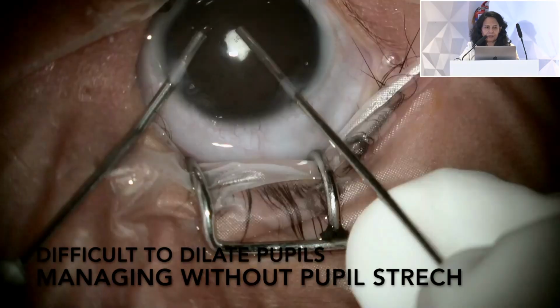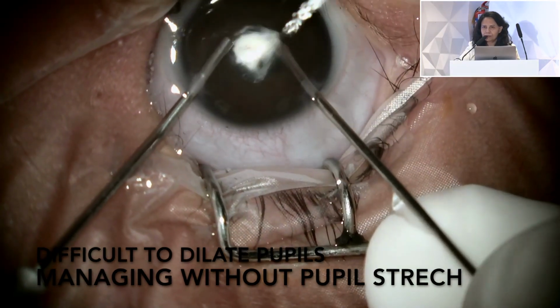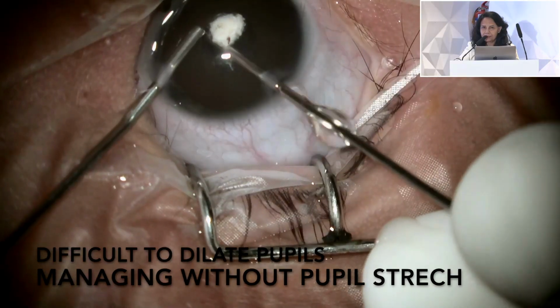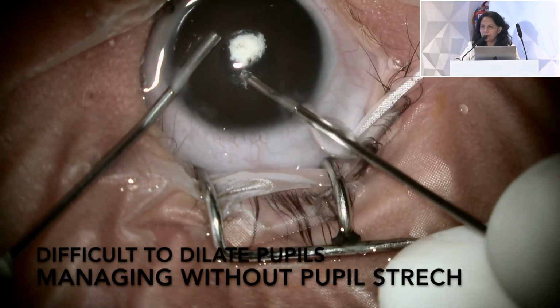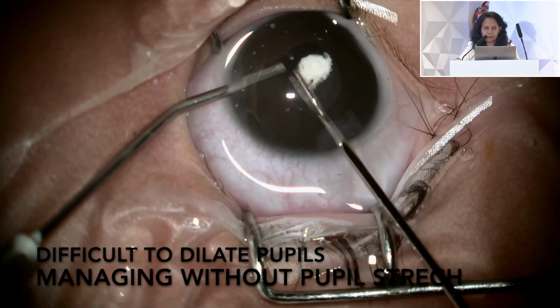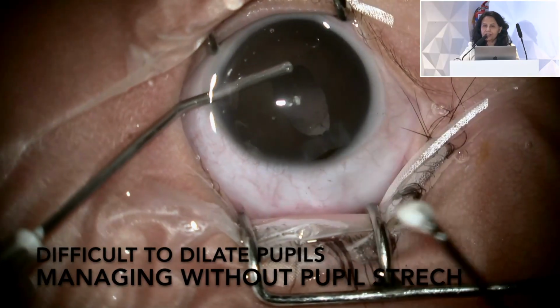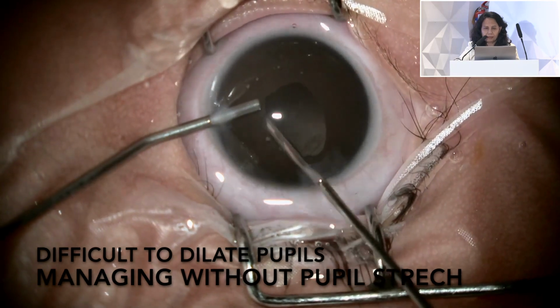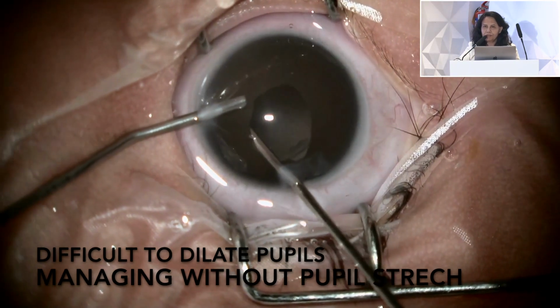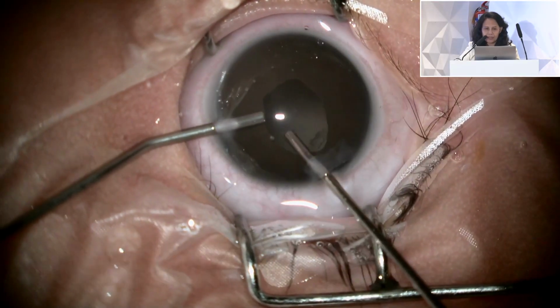And in the third video, this is a very difficult to dilate pupil, but the cataract was only in the center, that was the calcified plaque. With the help of the vitrectomy cutter, actually in almost all the cases, and with the small help of the intraocular scissors, you can take out the part of the cataract, and then the remaining you can just do the vitrectomy. So this way you can manage without dilating the pupil.